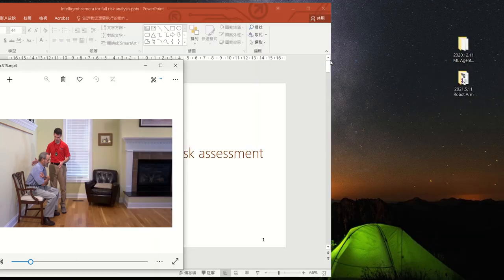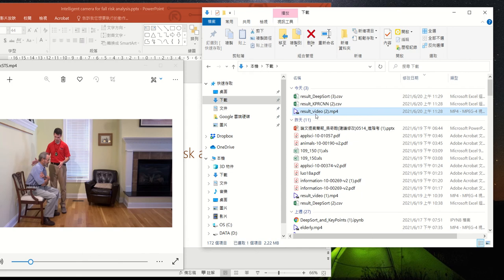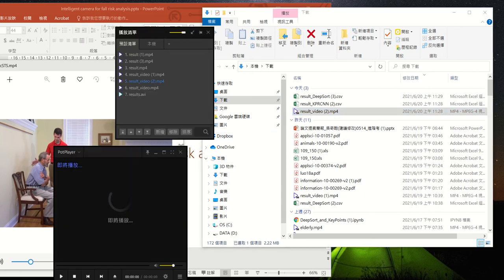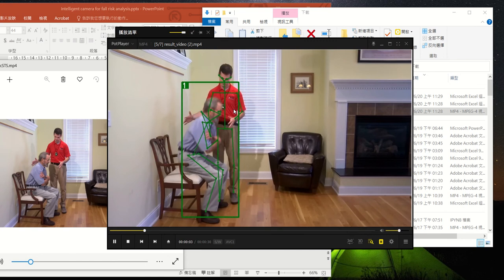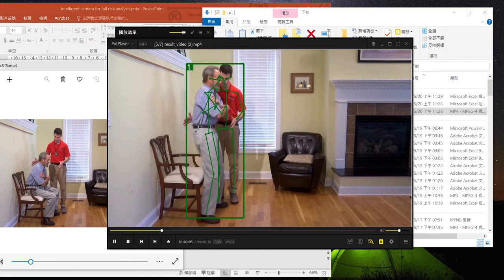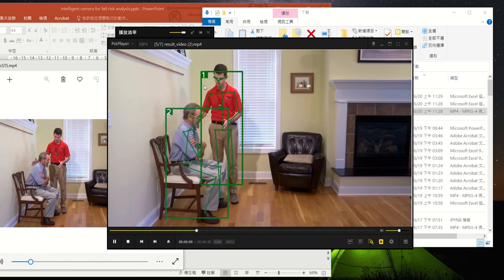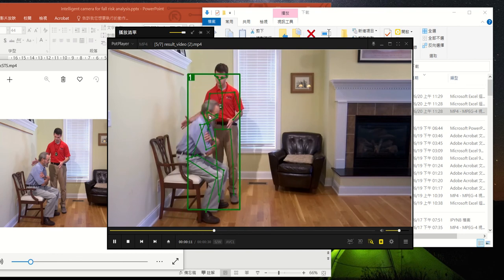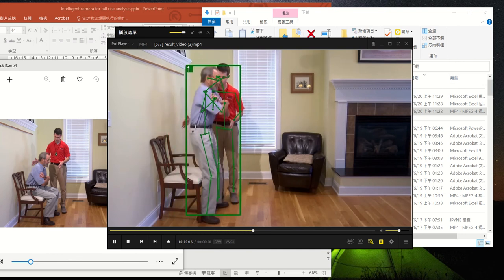Okay, let's take a look at the downloaded data first. As you can see, the DeepSort program is not stable. The subject identity keeps changing. At this moment, just record it. I will try to fix this bug.